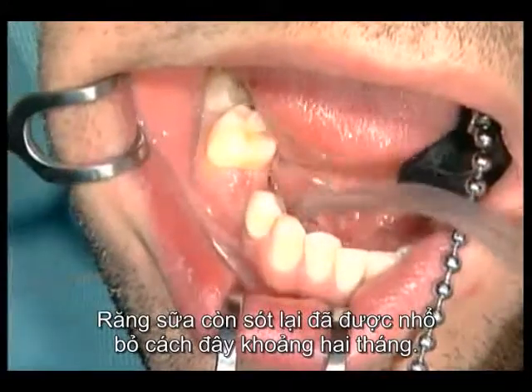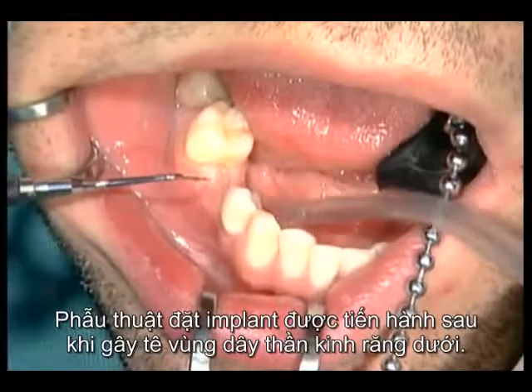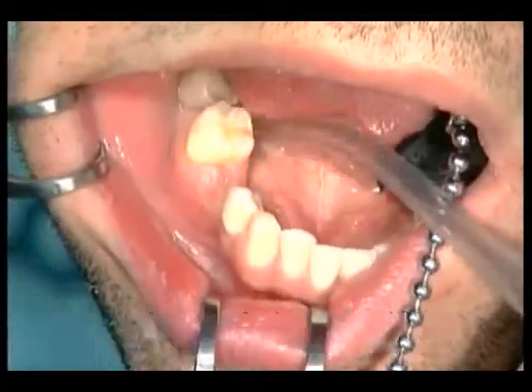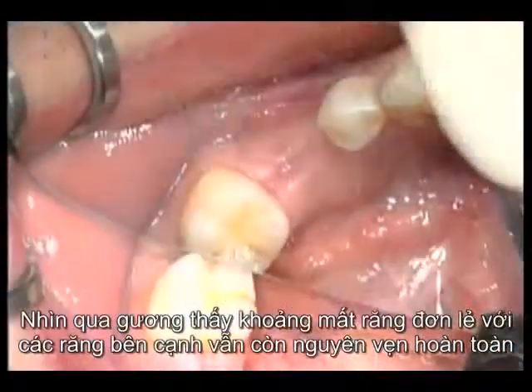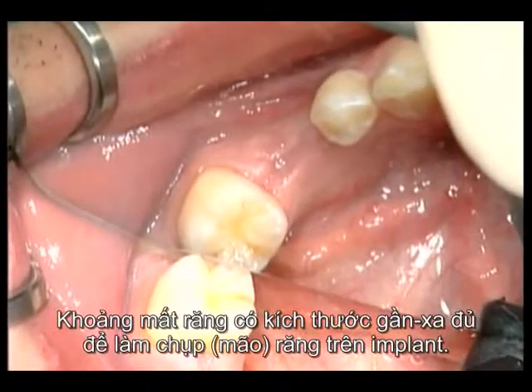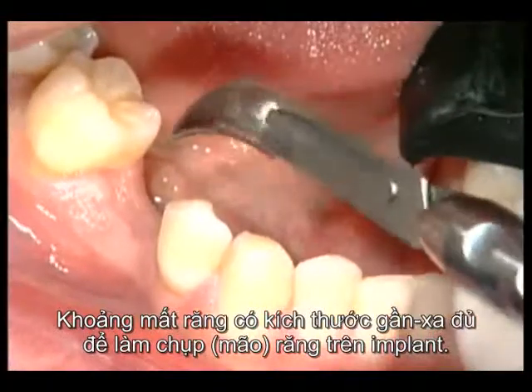The remaining baby tooth was removed about 2 months ago. The implant surgery is performed in a block anesthesia of the mandibular nerve. The mirror view demonstrates a single tooth gap with fully intact neighboring teeth. The gap has a sufficient mesiodistal dimension for an implant-supported crown.